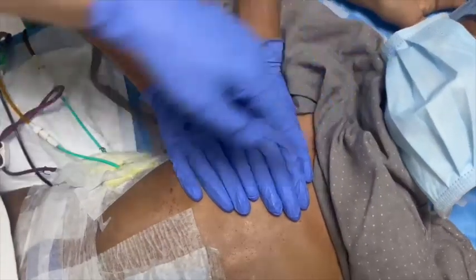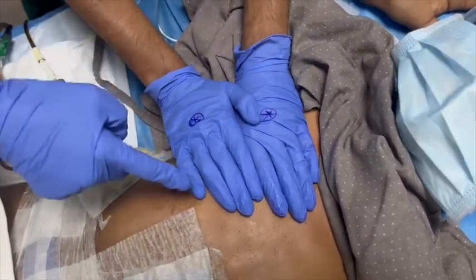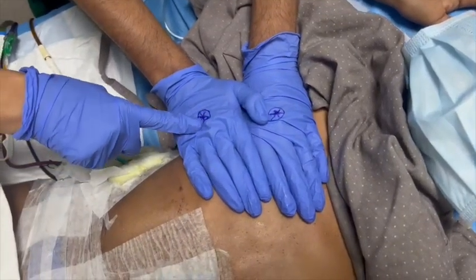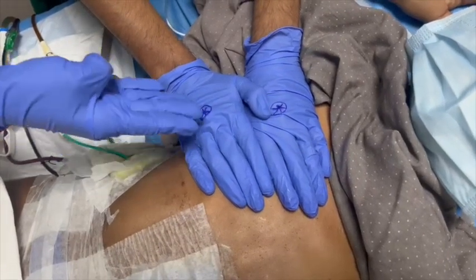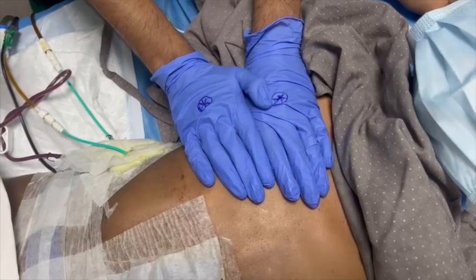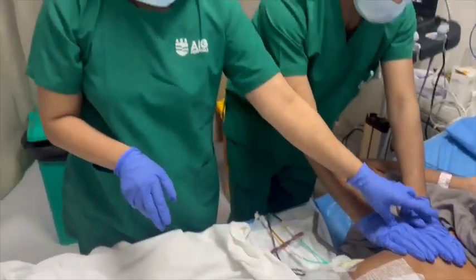This is formed by placing the 2 hands like this. The ulnar border of the upper hand is just below the clavicle and the tips are near the sternum. This is my blue point 1 and this is blue point 2. There's another point called the PLAPS point. When we draw a line perpendicular from blue point 2, intersecting the posterior axillary line, that point is called the PLAPS point, that is posterior lateral alveolar pleural syndrome point. So these points are used for scanning the lung.